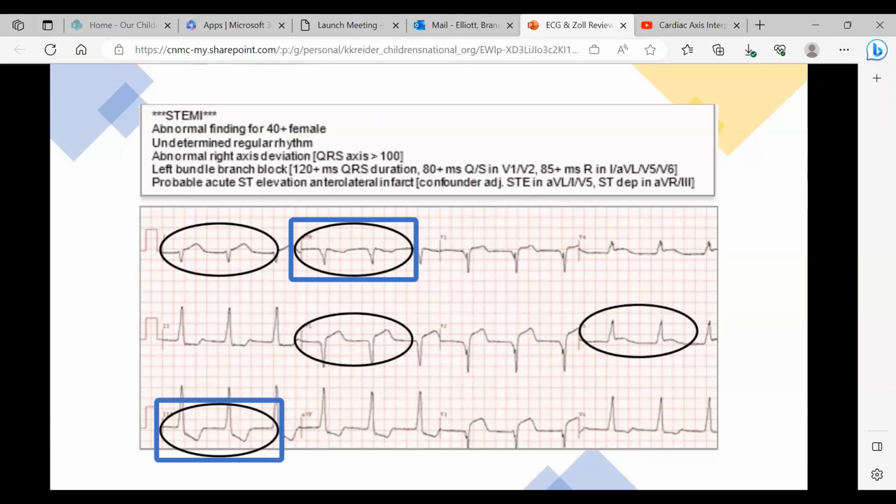And you're doing the turn signal if you have a wide QRS. That's why you're seeing those two downward deflections, the R wave and the R prime. That is kind of the two ventricles depolarizing at not exactly the same time because you have that heart block, and that's why it's elongated. Then you go to the J point, which is where the ST segment begins, and that's when you would shade, is it going left or right, up or down?